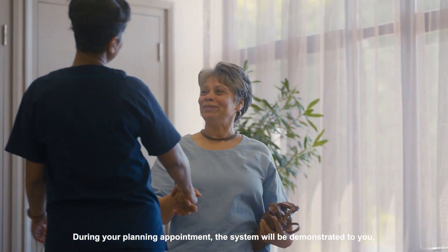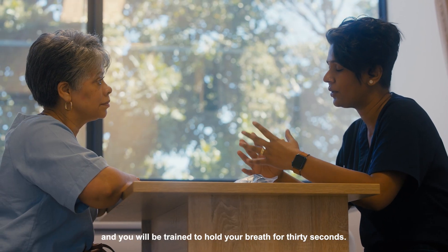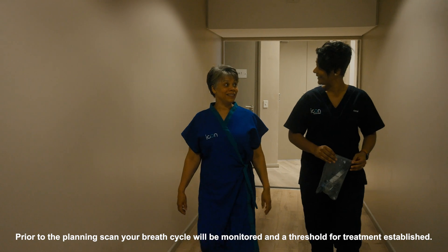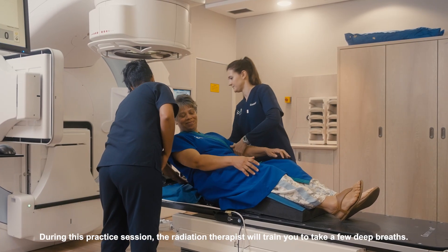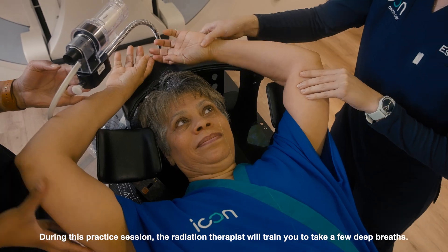During your planning appointment the system will be demonstrated to you and you will be trained to hold your breath for 30 seconds. Prior to the planning scan your breath cycle will be monitored and a threshold for treatment established. During this practice session the radiation therapist will train you to take a few deep breaths.